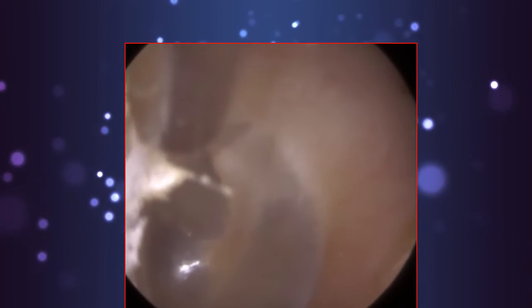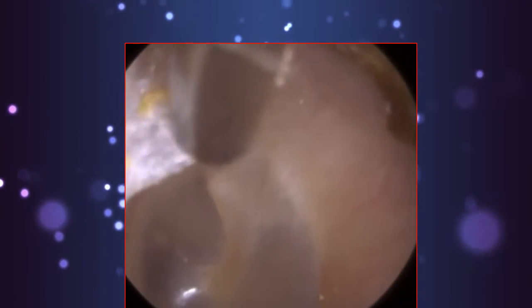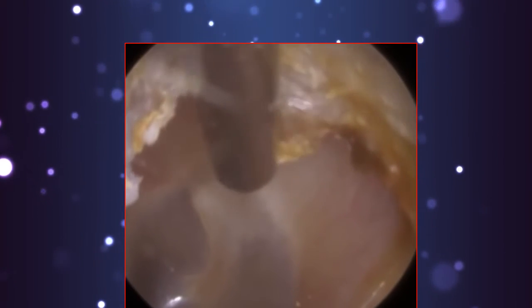So the tank itself, they're sterilising that every day. When you have your ears irrigated at the doctors or nurses in primary care, the irrigation system, just to kill any bacteria in the tank, they use a special sterilising tablet. So they're doing that. They're doing everything else fine. The temperature of the water is what it should be. If it's too cool, it can get the caloric effect as well.